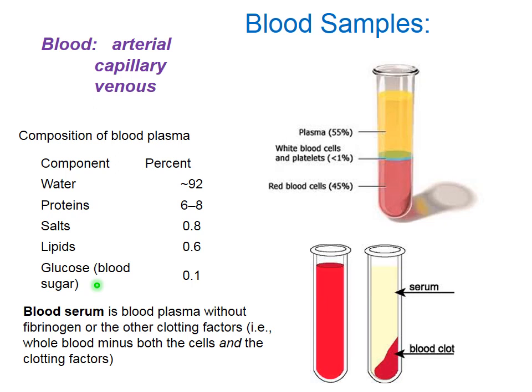Otherwise, what we do, we add anticoagulant and then centrifuge our blood at around 2000 g. As a result, we have three layers: a red layer of red blood cells, almost one half of the volume, a thin layer of white blood cells and platelets and some proteins, and then we have around half of the volume being yellowish plasma, still containing lots of protein, and of course the anticoagulating agent.